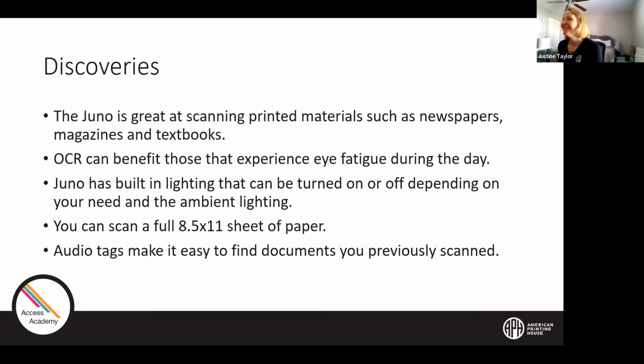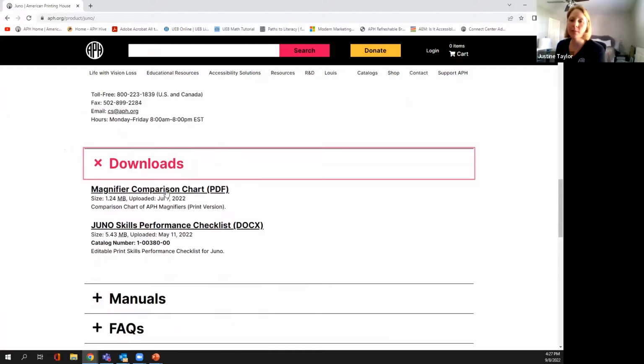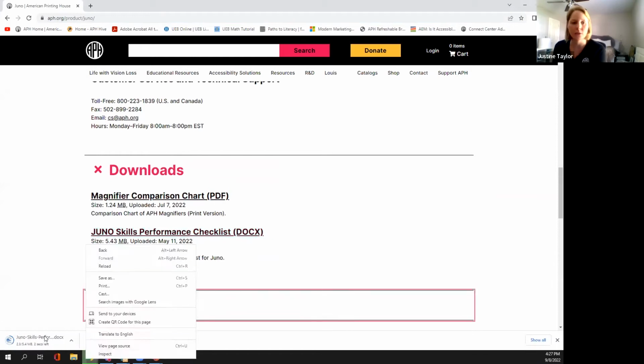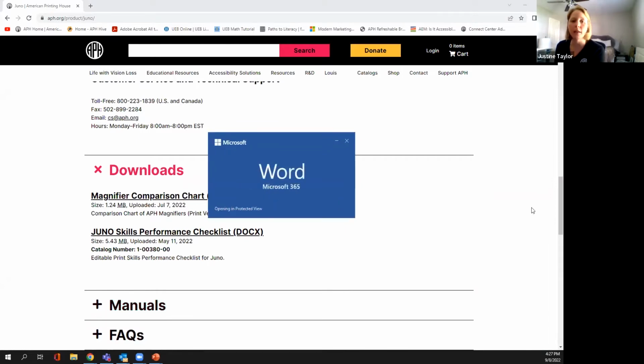Well, Justine, what's the answer to the question? Yes, there is a checklist that you can download from the product page, and I'm sure we can get the link. I can share it in the chat right now. Yeah, and it's just right on the product page for Juno on our website, and you can go to the downloads section, and right there you'll find the checklist, and it's a way that you can do a skills monitoring for your student or client that you're training to use the device.